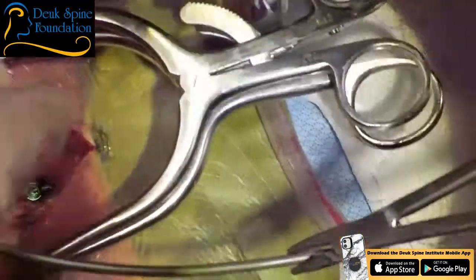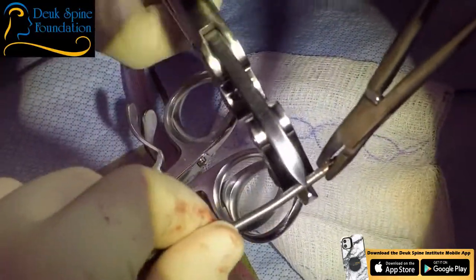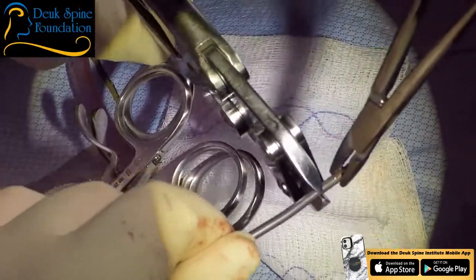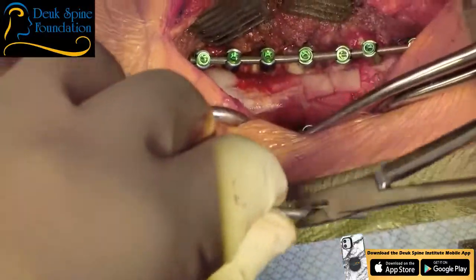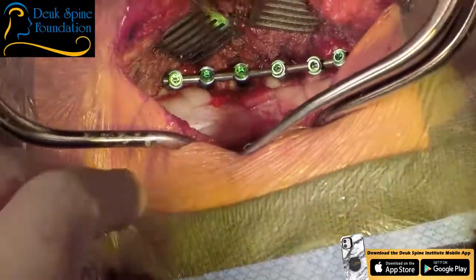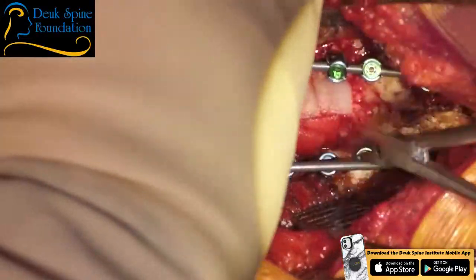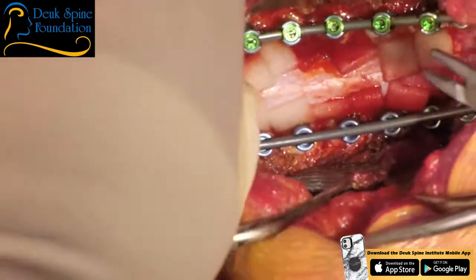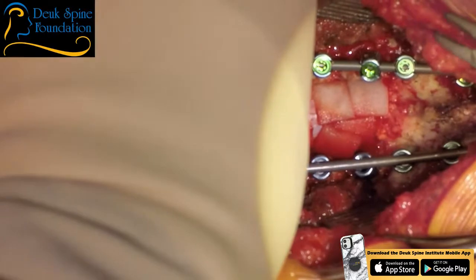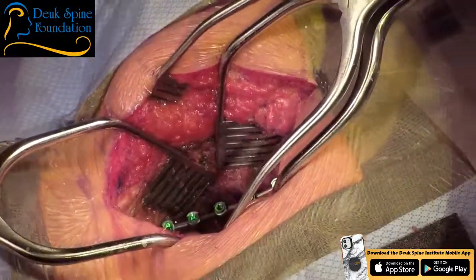All right, I cut it very conservative. I may need to cut it one more time, but let's just at least get this out. If you have too long of a rod, you'll start tearing up the muscle at the bottom, and it'll start bleeding. I want to avoid that. It's perfect there. If I do it this way, we'll get some kyphosis, which I don't want. So I need to bend it a little more.